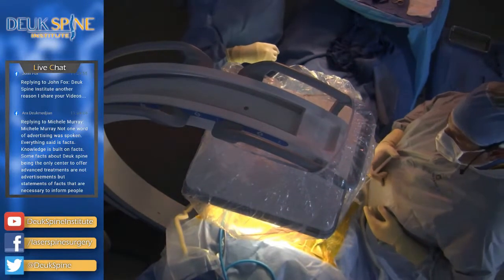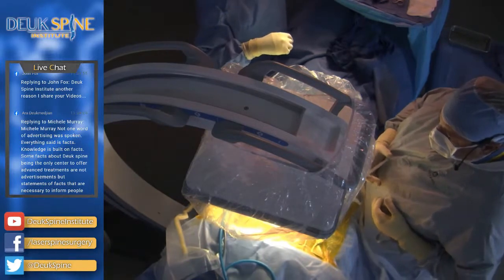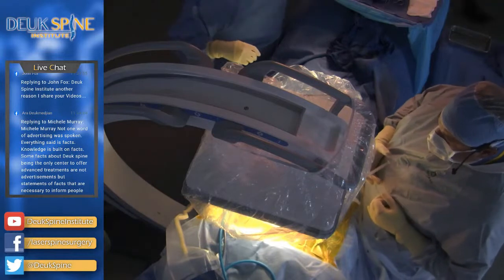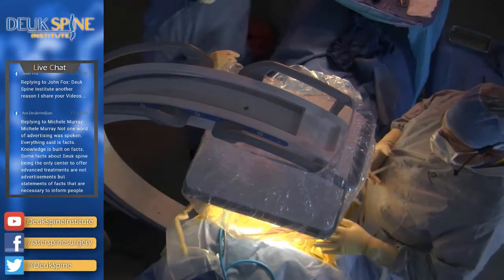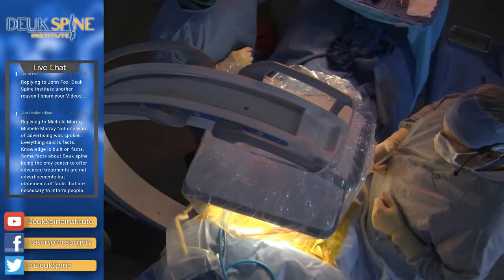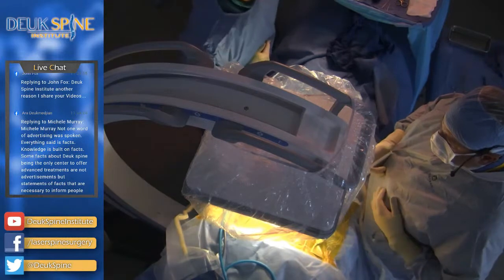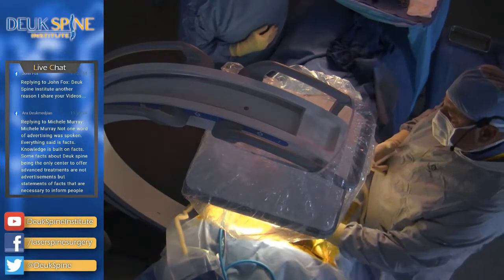Now, I'm going to give you some numbing medicine under your skin. It's going to burn a little bit. You're going to feel a little poke and a burn, okay? So don't try to move throughout the surgery. If you feel any pain, you let me know by saying, ouch. Deal? If you say ouch, then I'll give you some more medicine, okay? All right. We're going to get started.